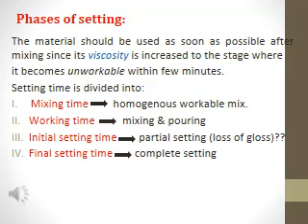As the reaction proceeds, the material passes through certain phases, and we should use the mix as soon as possible after mixing. If you don't, its viscosity will begin to increase until it reaches a point where the material has high viscosity and cannot be poured inside the impression. It will be unworkable. So you should pour it immediately after mixing.